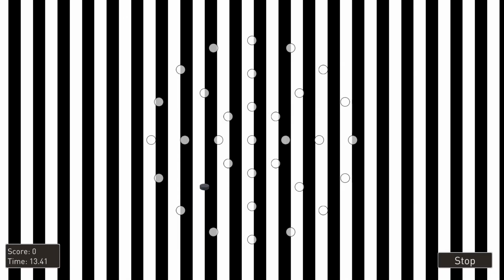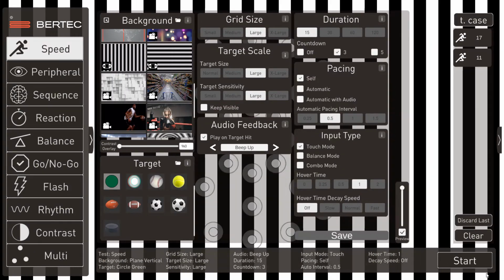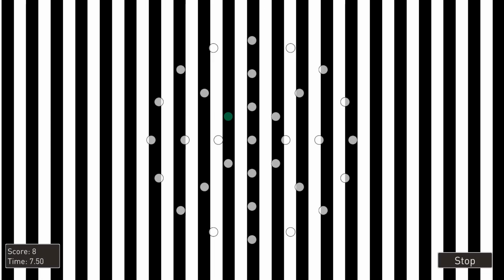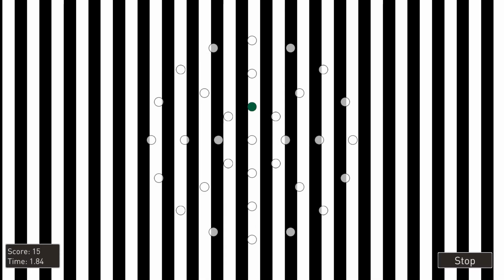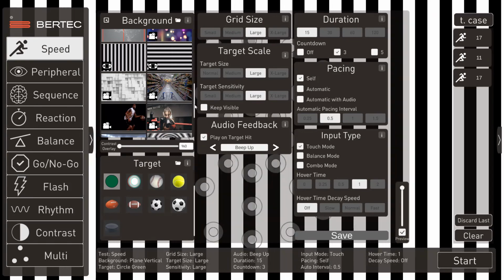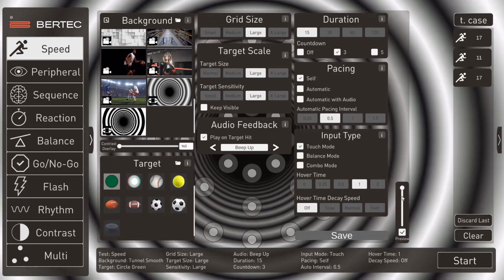Again, they're there to touch the green dots. The interesting part is that the stripes are stimulating a pursuit movement to the left and a saccadic movement to the right to pick up the next set of stripes. And all the time this is going on, they have to control the central vision to move a saccade to those green targets. So this becomes very, very challenging. We can help them by reducing the contrast and slowing down the speed. Once we've done that, we want to just, of course, make it more difficult.